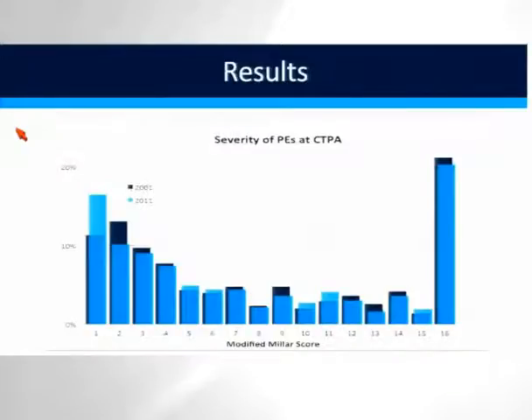And this was quite surprising. When we looked at the data from 10 years ago and our more recent data, and now obviously this table has been corrected for numbers because we're now diagnosing a lot more emboli. When we looked at the proportion of the Miller scores throughout the positive scans, we see that the disease severity pattern hasn't changed substantially over the last 10 years.